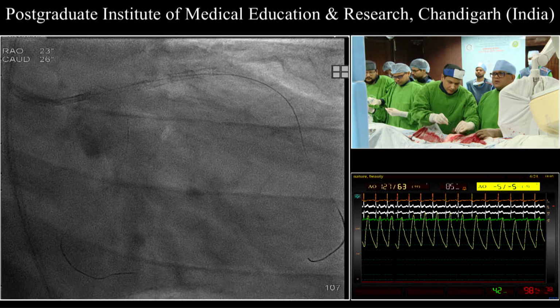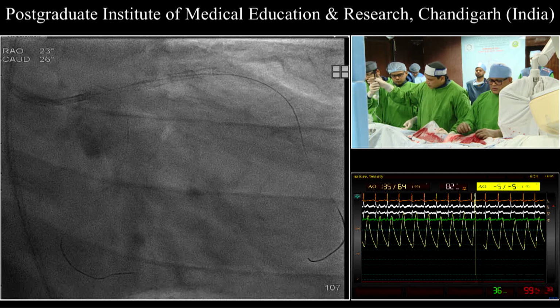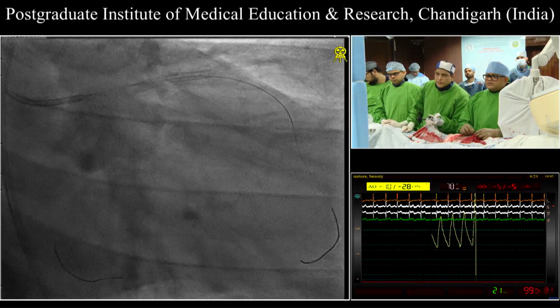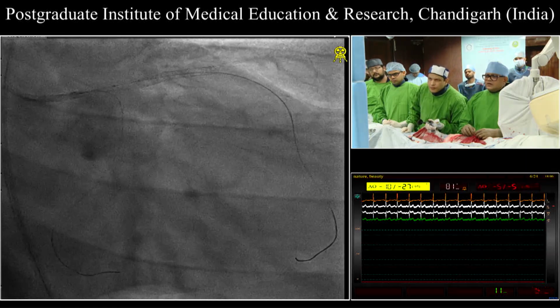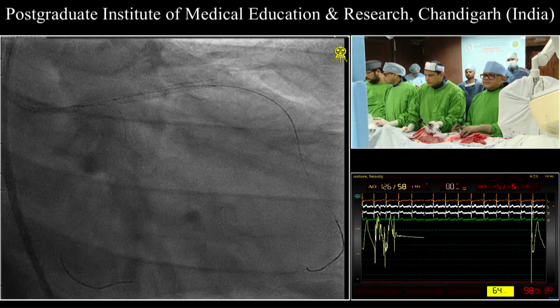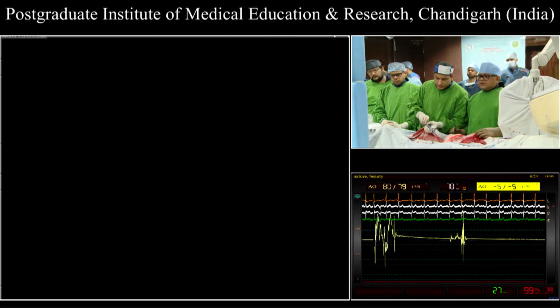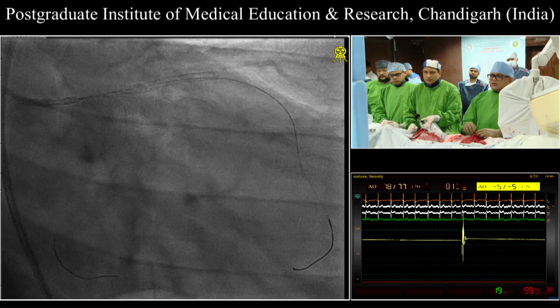The question is though, I think the length of the left main stent is too short to do a POT for the carina. So we have taken the 8 millimeter balloon. 8 millimeter or 6 millimeter? No, it's an 8 millimeter. Which length of the balloon? It's an 8. I don't have a 6. Go ahead. So 8 is maybe a bit long. I don't know. 12 negative. And of course we don't want the balloon outside the stent. Yeah, that's right.